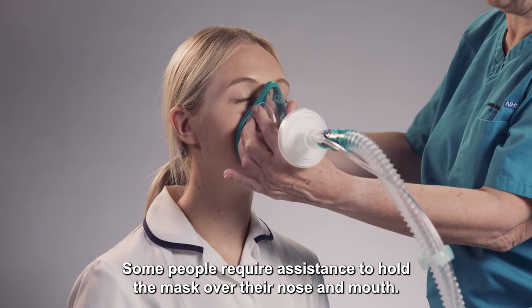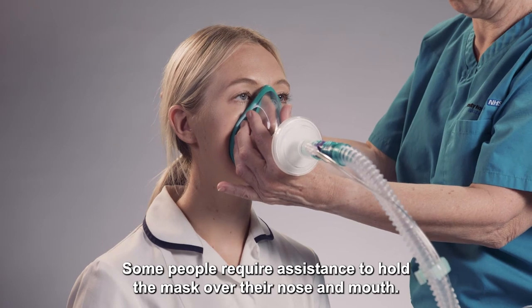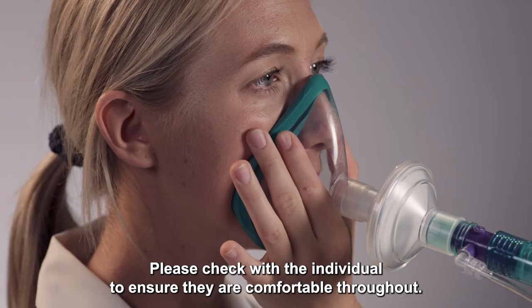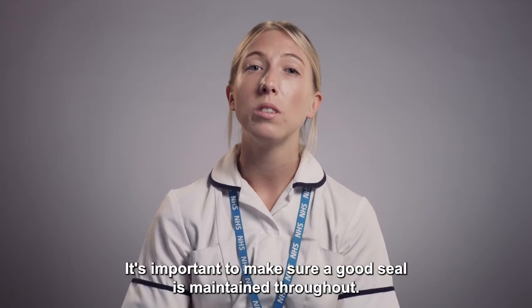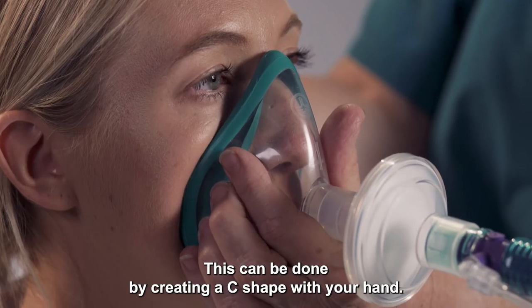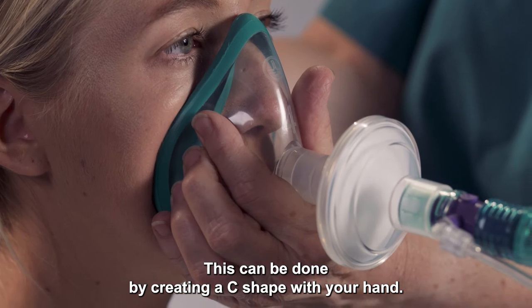Some people require assistance to hold the mask over their nose and mouth; others may be able to do it themselves. Please check with the individual to ensure they are comfortable throughout. It's important to make sure a good seal is maintained, which can be done by creating a C shape with your hand.